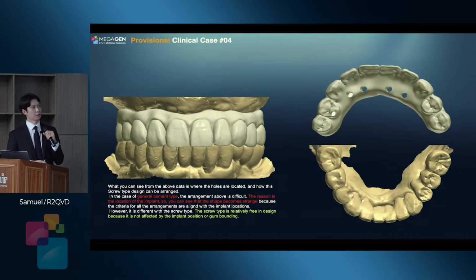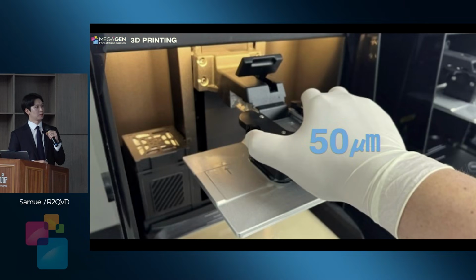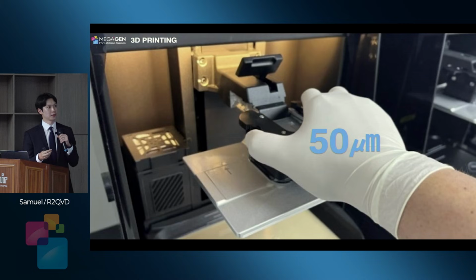then using, this case is a live surgery case, so we don't have any option. We cannot mill. Normally, for an edentulous case, the milling time is over 2 or 3 hours. So we're using the 3D printer. And it's okay because nowadays 3D printer resin is very good. And also in All-on-X cases, especially edentulous cases, the thickness is not thin, it's thick. So it is strong enough for the arch. So that's why we choose the 3D printer.